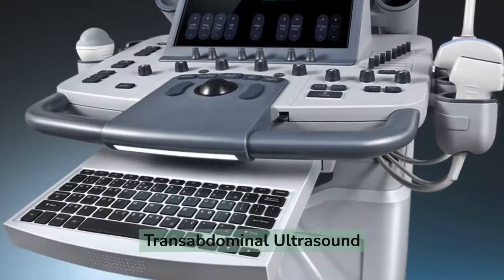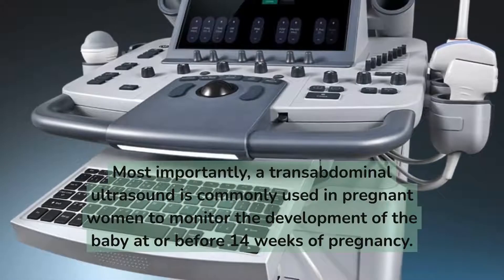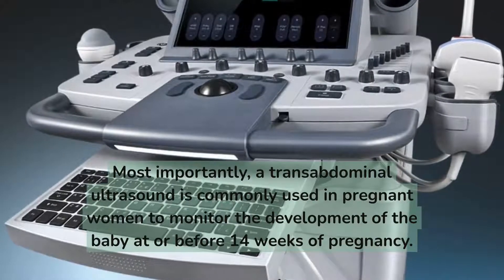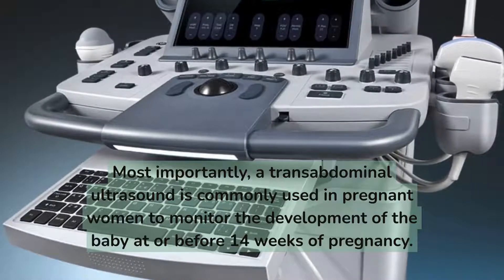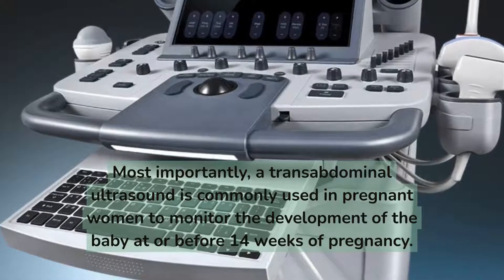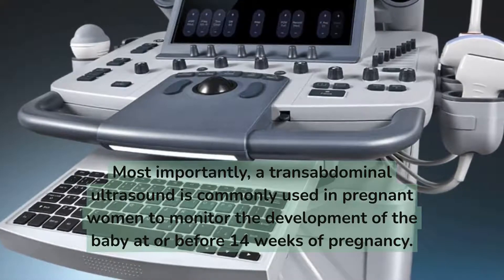Transabdominal ultrasound. A transabdominal ultrasound is commonly used in pregnant women to monitor the development of the baby at or before 14 weeks of pregnancy.